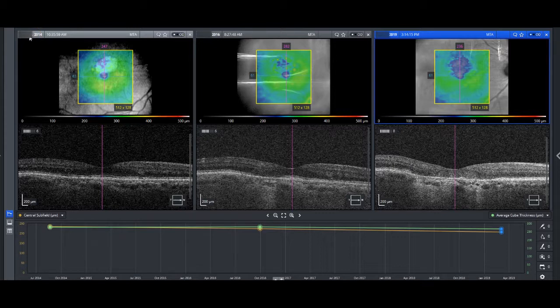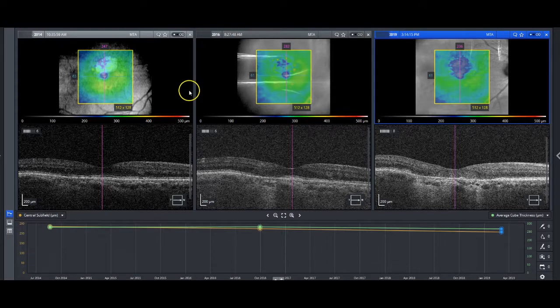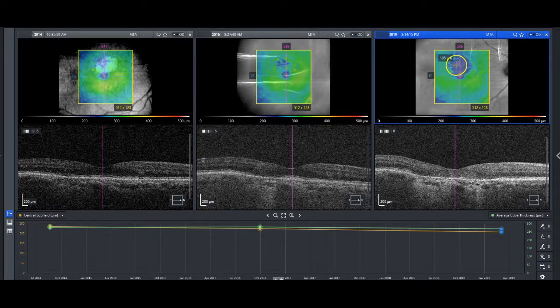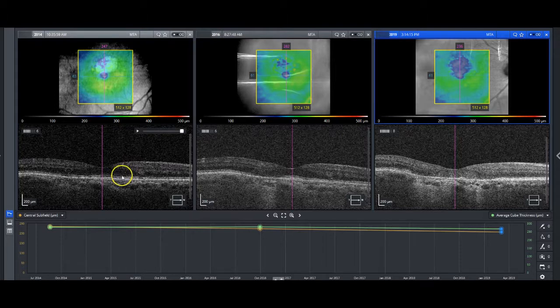Let's just quickly orient the dates. We've got 2014, 2016, and 2019 in terms of the timeframe, and very quickly looking at the maps here on the OCT, you'll notice a little bit of blue, a little bit of thinning. Not much change, but wow, there's a lot more. If you look down below, you actually get your answer as to what's going on with this patient.